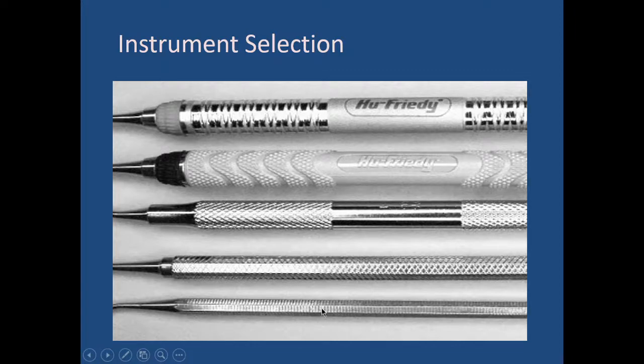Because this one is hollow. This one is not a hollow instrument, so it will be much heavier, and it has a small cross section. The small cross section will be different in application. It needs more force from your hand to apply its action. This is for this one, but this one needs light force, or does not need more force, to apply its action.